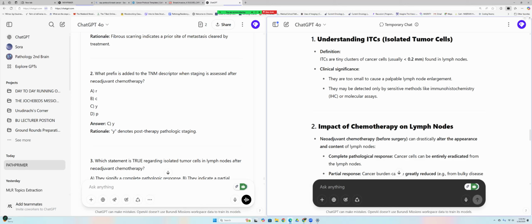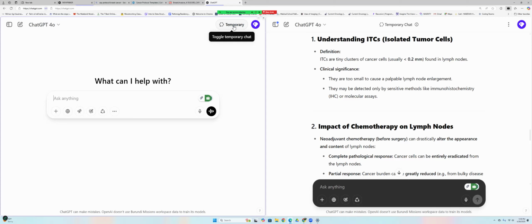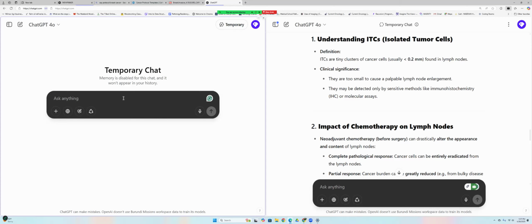You know that sometimes lymph nodes will just look blue under the microscope. So what kind of IHC will they use to detect if there's a tumor in the lymph node? To detect tumor in the lymph node, like breast cancer, maybe you can use CK5, CK6. Use epithelial markers. What are the most popular epithelial markers you know? I started one. I said CK5, CK6.